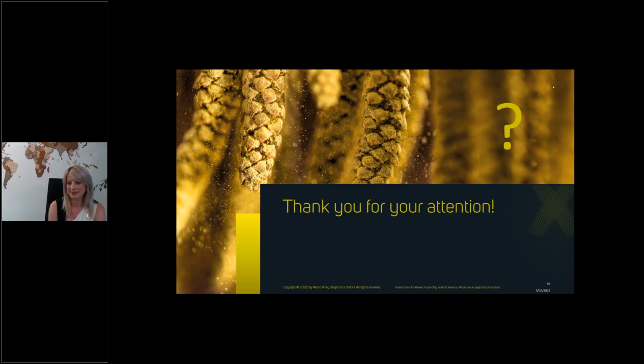Okay, so a question is, someone's asking if they're running the ALEX panel or the FOX panel at their institution, what is the recommended quality control material to be used? So we recommend to use the Lymphocheck from Bio-Rad IgE control.